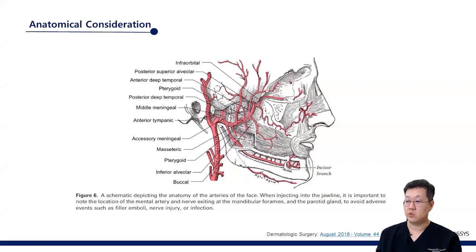But be careful if you're using tumescent anesthesia or solutions, because it diffuses a lot of heat inside, and with multiple passes or more energy there is always a risk. I will share my experience on avoiding that kind of damage during the hands-on time.